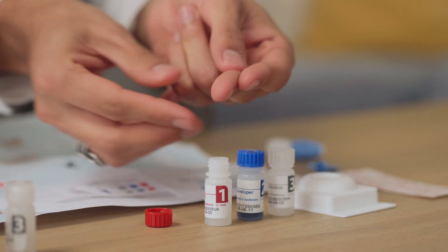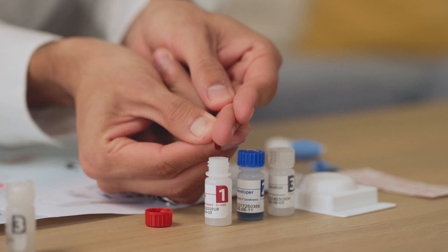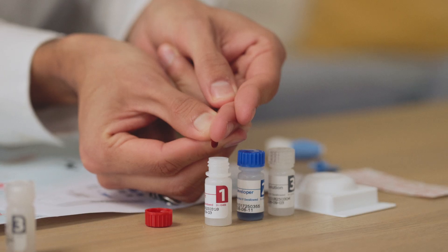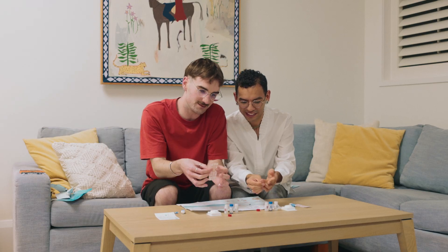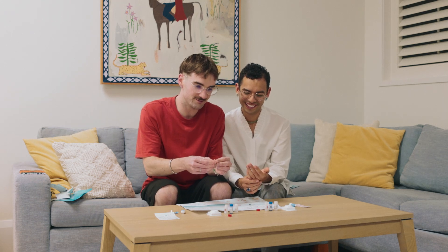Step 4. Holding your finger over bottle number 1, gently squeeze down your finger until one drop of blood falls into the red bottle. Do not scrape the blood into the vial — it needs to drop in freely to ensure the right amount is added. Now use the plaster provided to cover your finger.